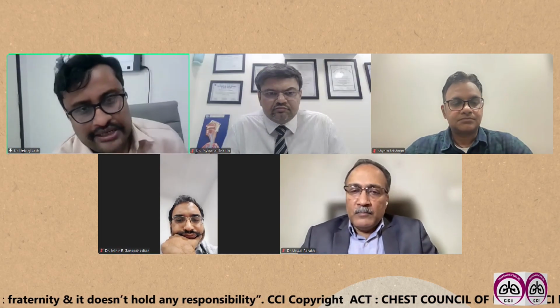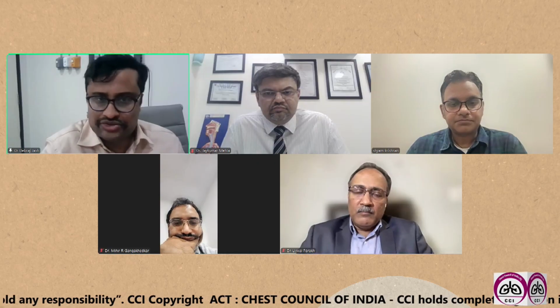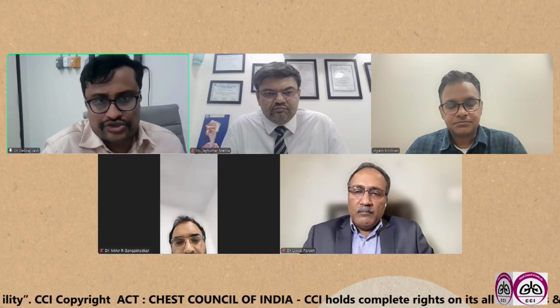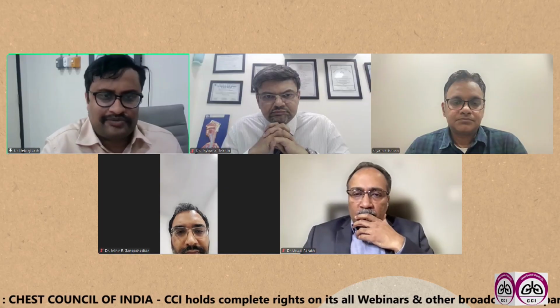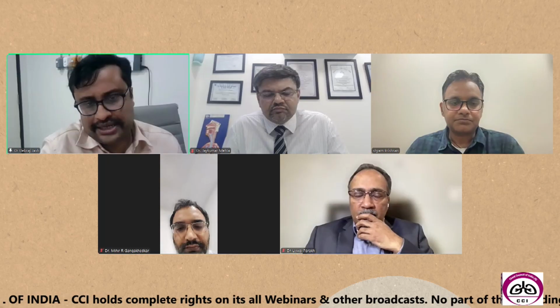Again, Sam, I'm returning to you. Because of the competition factor, because of the need to look after the cost, as you rightly pointed out, many times we are reusing the needles. The only reason is cost. So what is the maximum number of cases or individuals in which you would recommend that it can be used?